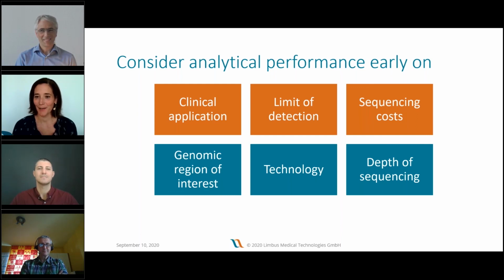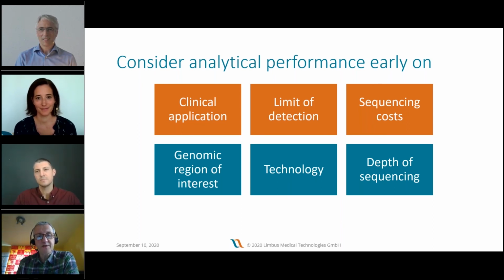There's another question to Peter. Are your probes ssRNA, ssDNA, or dsDNA? Our probes are single-stranded DNA probes of 120 nucleotides, biotinylated.